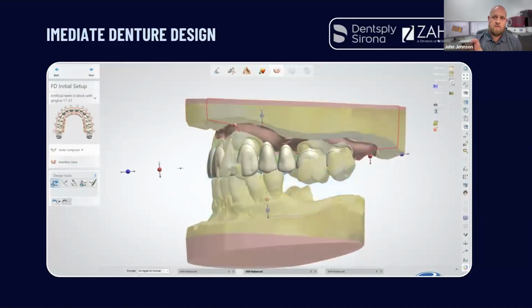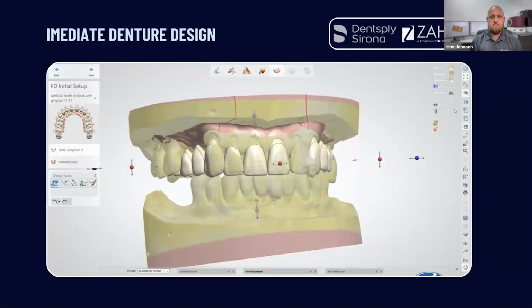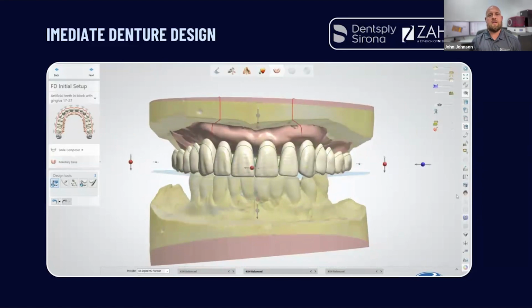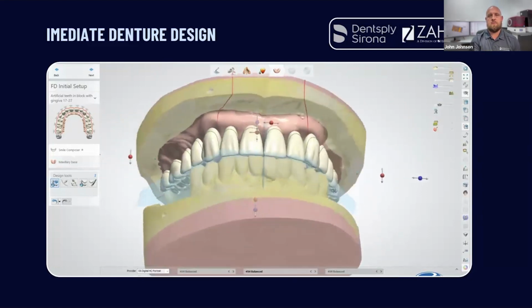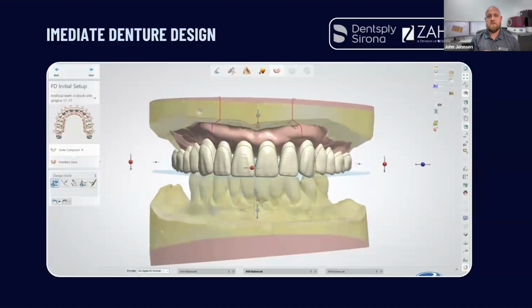upper right-hand corner, the tooth with the little gold round dome on it, is that original scan that is their existing dentition. So I'm able to create my smile design overlaid over there. So I can follow cants, I can follow any kind of nuances that person already has. And that's something that you have to really communicate with your doctors, and I showed them this exact slide because this denture is a little bit canted.